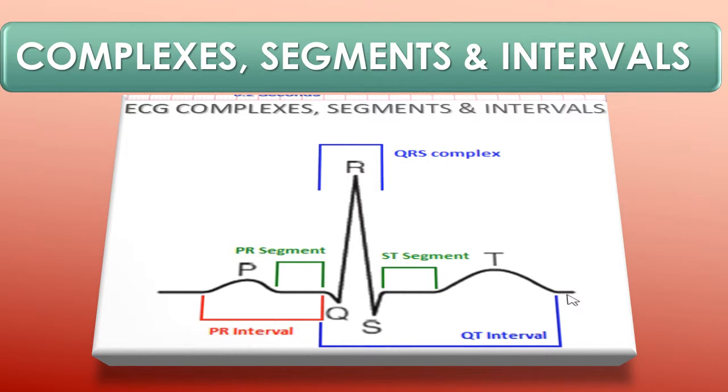Your textbook talks about what is sometimes called a U wave. A U wave follows a T wave, resulting from slow repolarization of the Purkinje fibers. It has the same polarity as the T wave, but generally it's common in lead V3 and not seen in all leads.